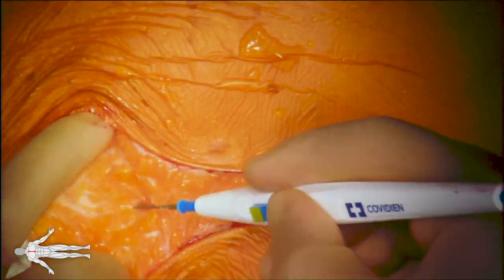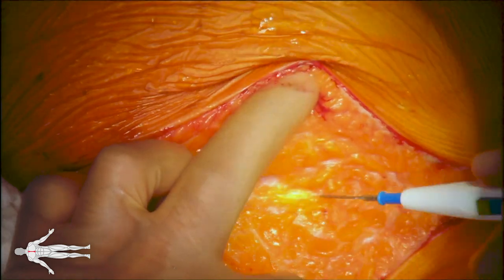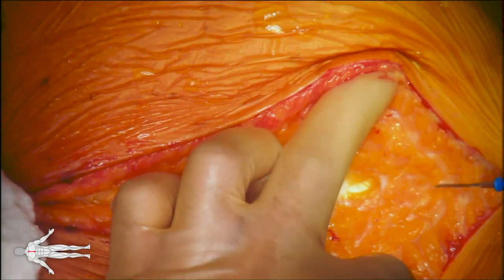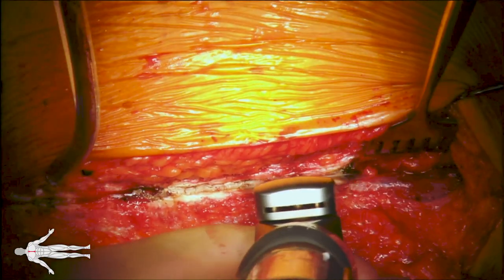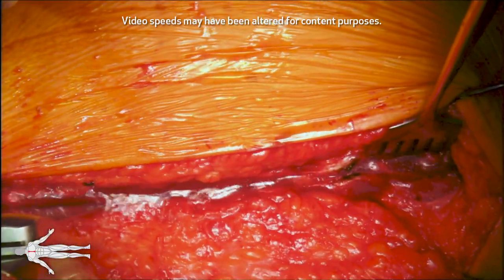The patient's prior aortic valve replacement was performed via right anterior thoracotomy. Therefore, we performed a redo reduced sternotomy using an oscillating saw.